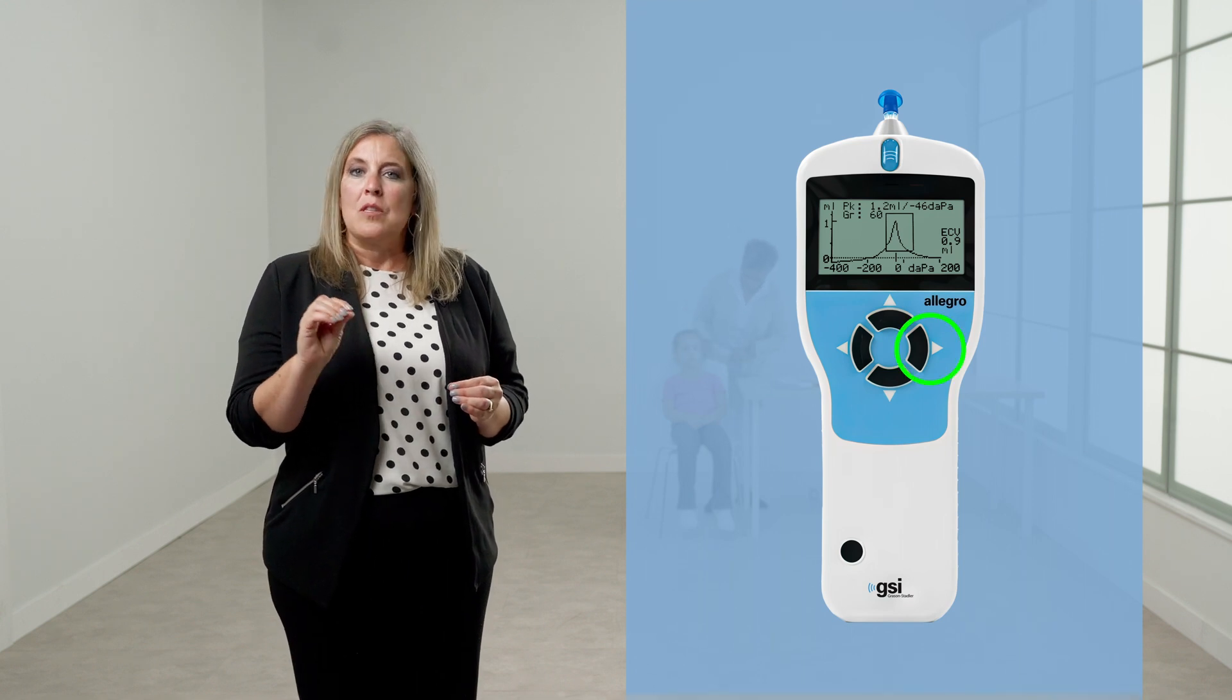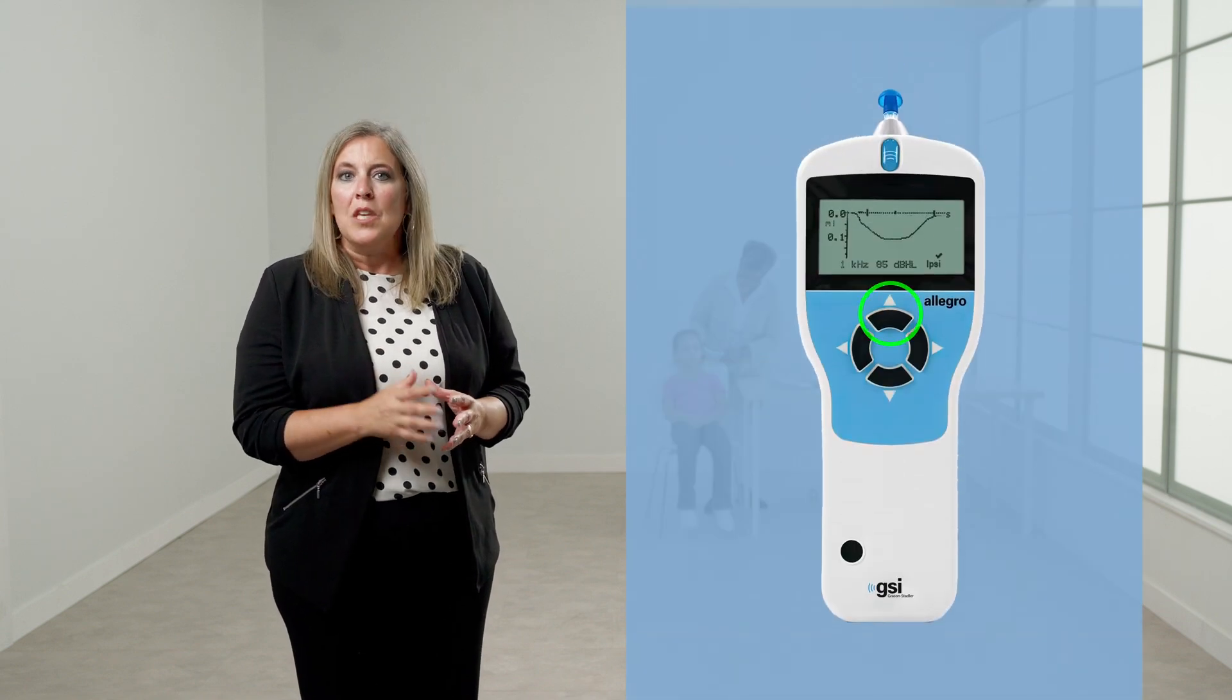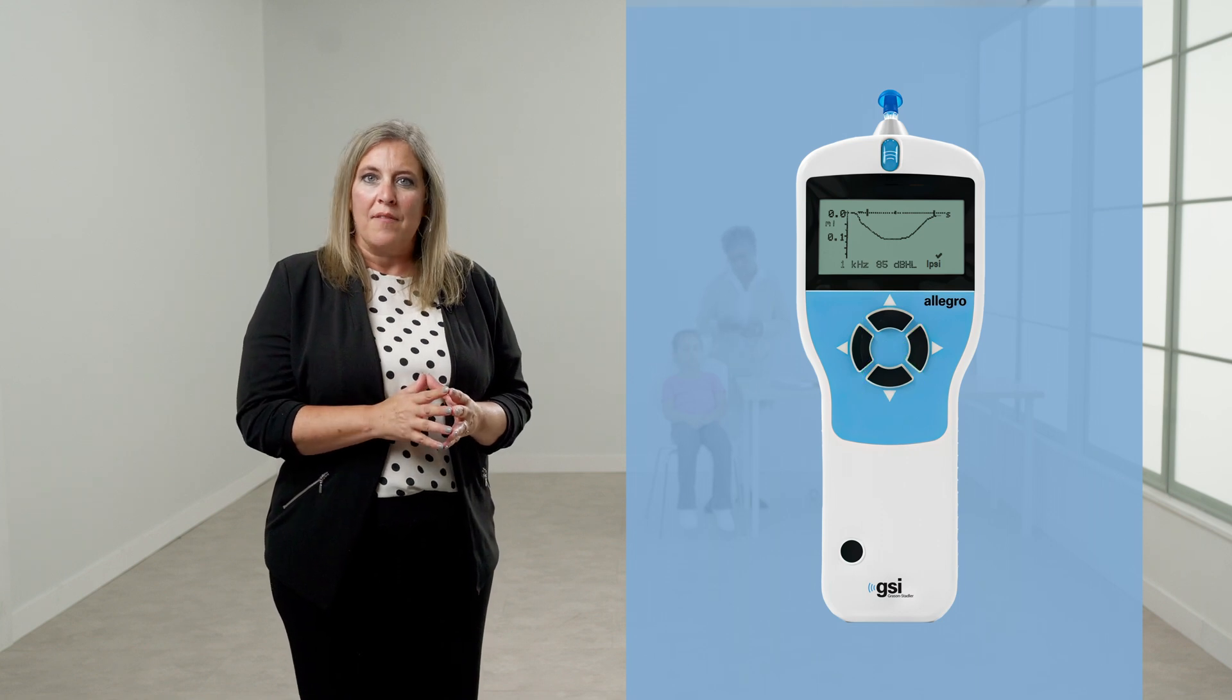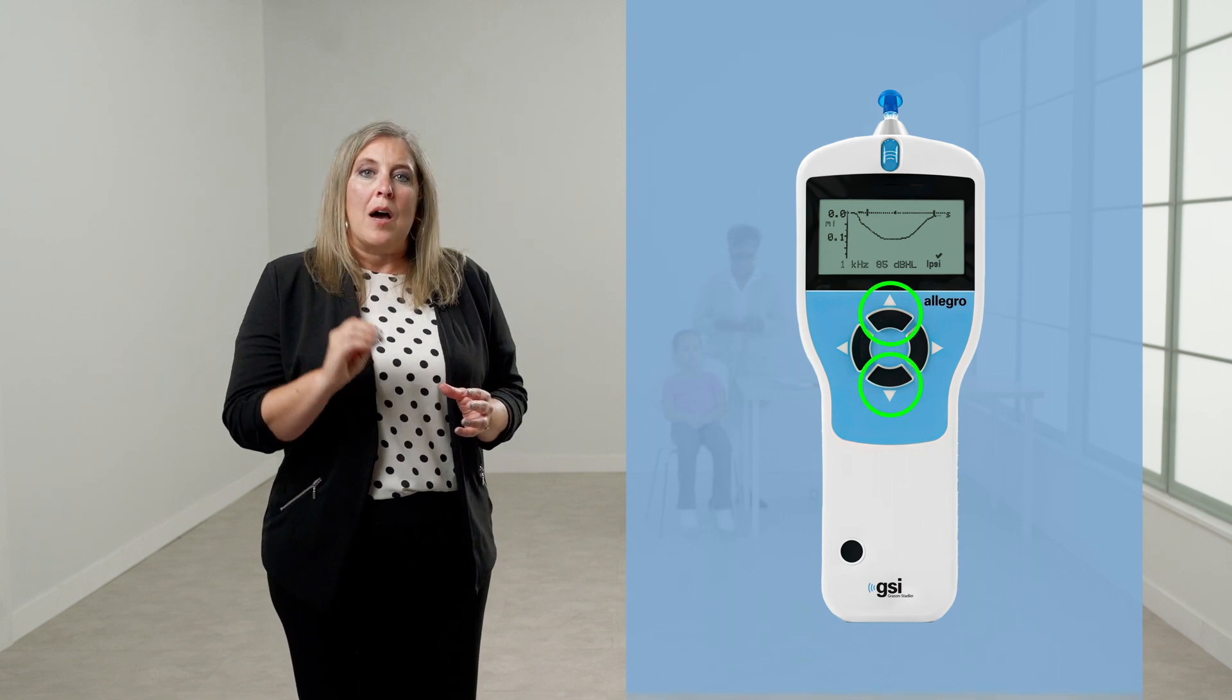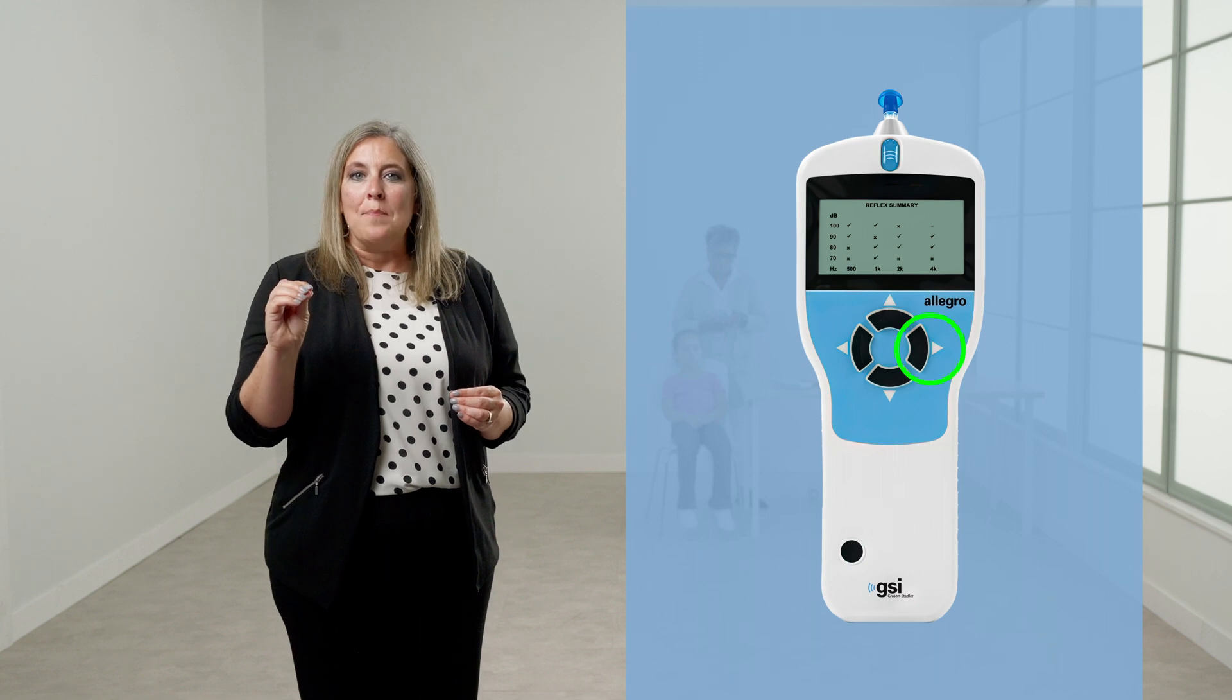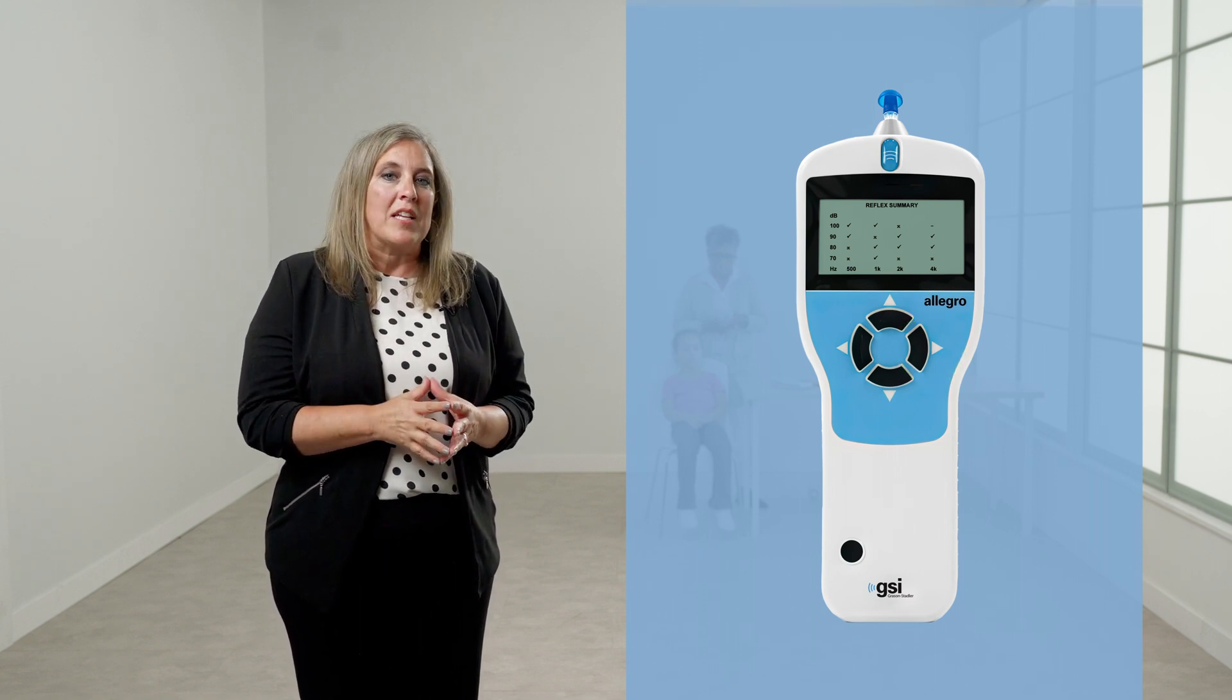Review the tympanogram and press the right button to accept it. If the reflex test was performed, the results will be displayed. Use the up and down buttons to view the results for each of the reflex tone levels used. If the reflex test was performed at more than one frequency, use the up and down buttons to view the results for the additional frequencies. If the Allegro was set to test for a reflex at all levels of the stimulus, press the right button to view a summary of the levels and frequencies at which a reflex was detected.